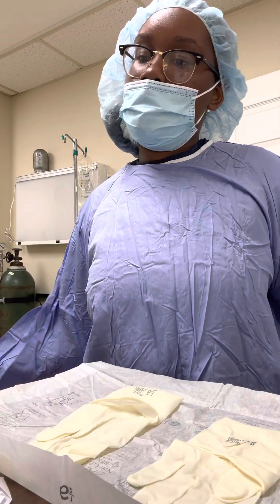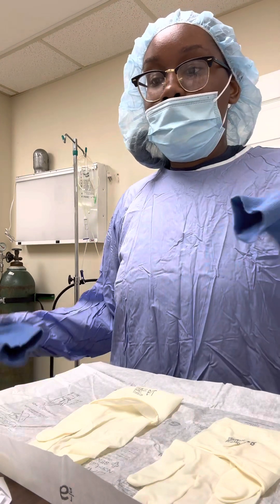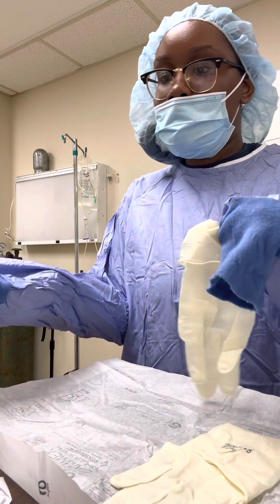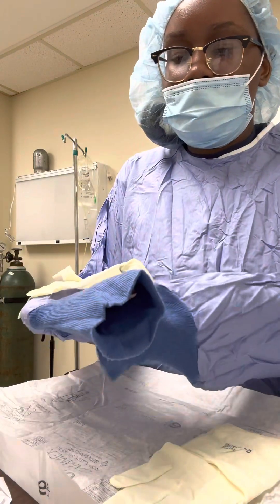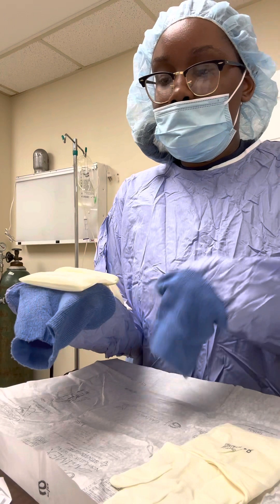Make sure I'm all comfortable and everything. I am going to pick up my non-dominant hand glove, which is my left hand, with my dominant hand. I'm going to lay the glove on my hand with the glove fingers pointing towards my elbow and my thumb laying on my sleeve.